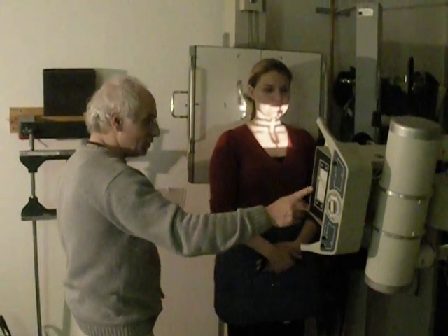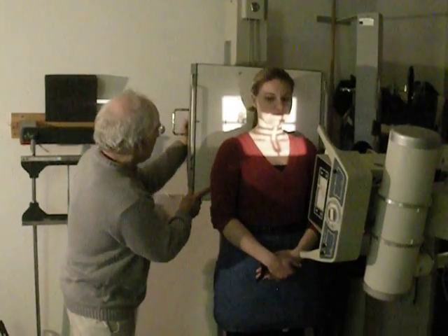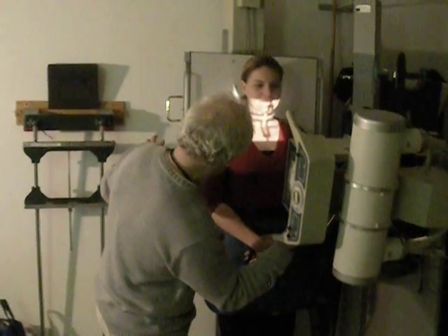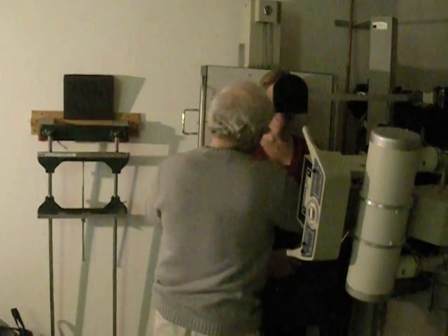Remember, 3 things that need to be centered. This tube, this patient. Now we're going to put the 3rd thing in a line. Close this collimator down. And we'll bring forth our eye shields because we care.